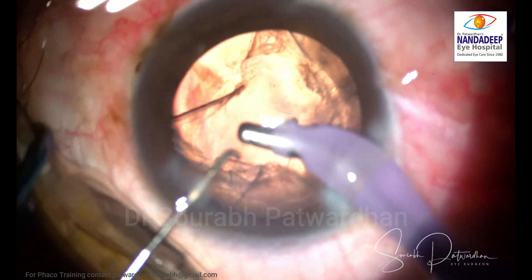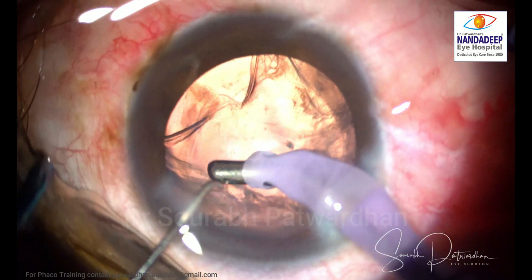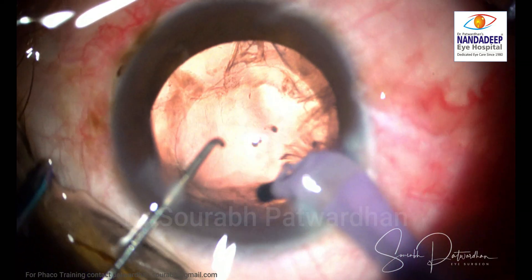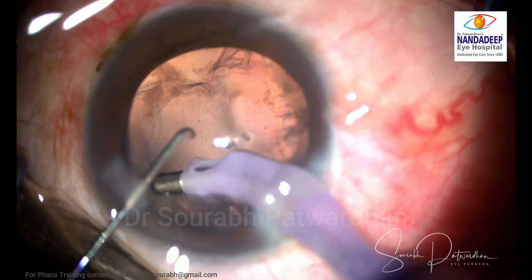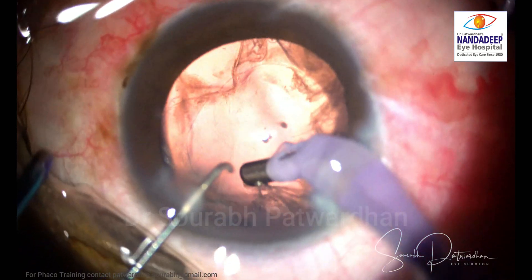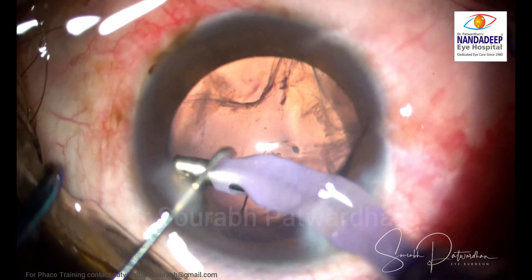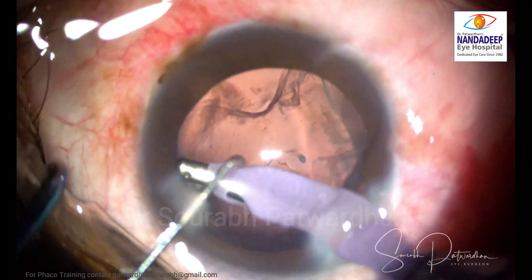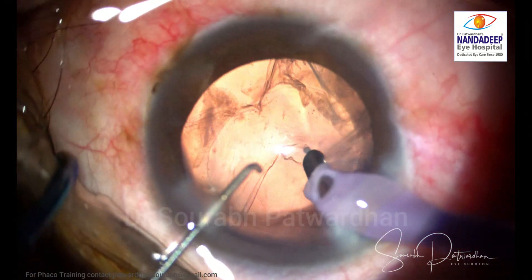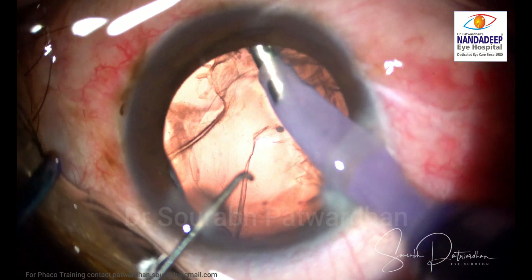For irrigation and aspiration of the cortex, notice the tangential movement of my probe as compared to the usual centripetal movement. This is because the cortex is entangled in places around the CTR ring. If you pull centripetally, the CTR will not allow movement of the cortex. In such cases you have to move it tangentially — look at how I move it tangentially so the cortex moves over the CTR and comes out.